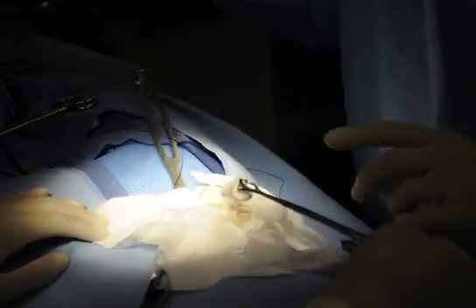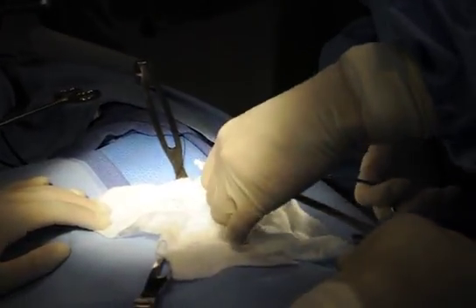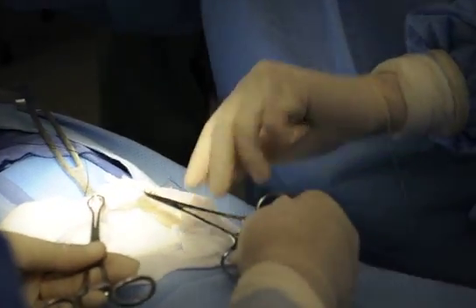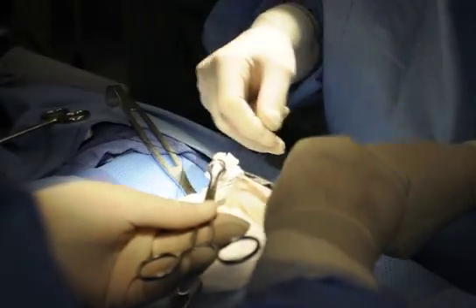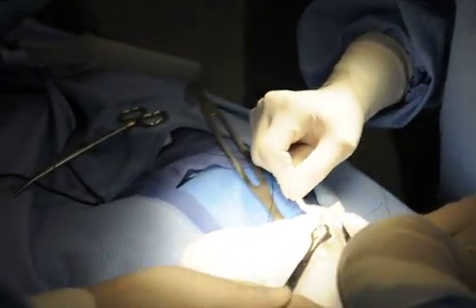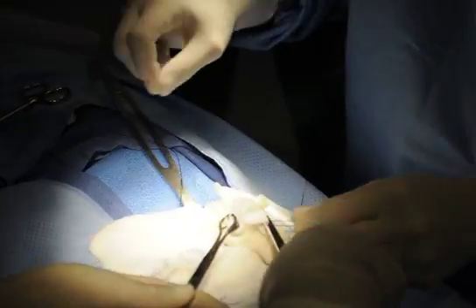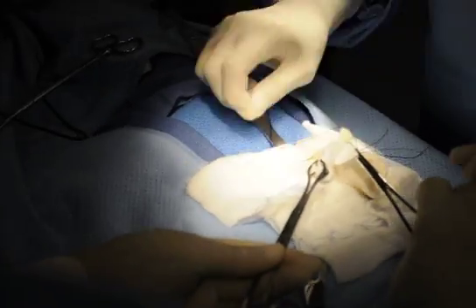So now I need a straight clamp. We're going to crush the base of the appendix, then they're going to move it up and we're going to tie this on the area that we crushed. Now if you don't take that clamp off, what's to stop all that juice from leaking down when you take it off? Nothing. So you leave that on. I'm also going to be cutting against that.